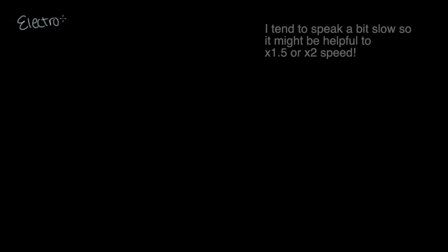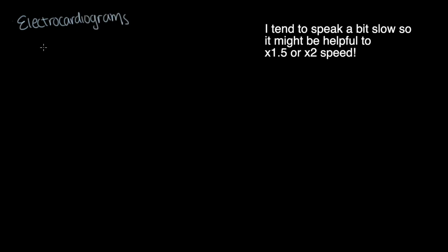So this video will be going over electrocardiograms, and this video will be very helpful for people who are learning ECGs for the first time. And we're going to take this step by step.